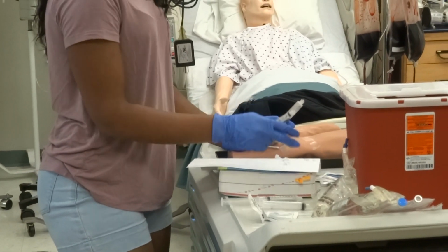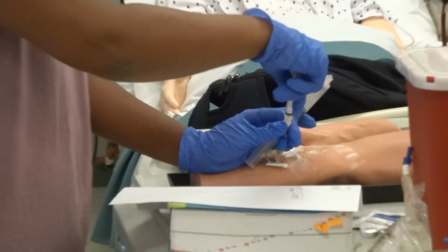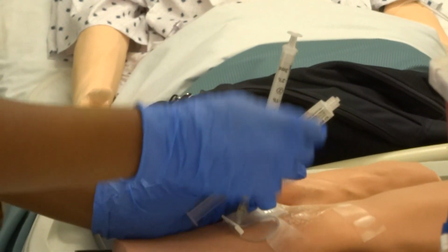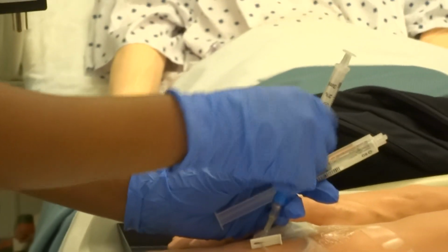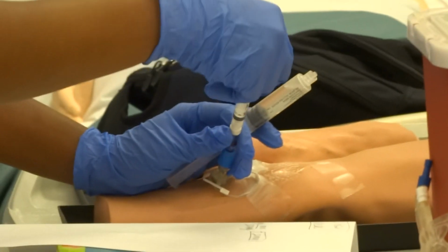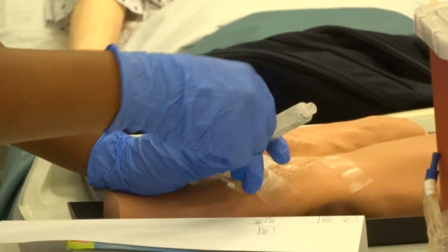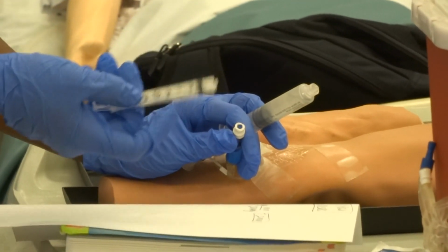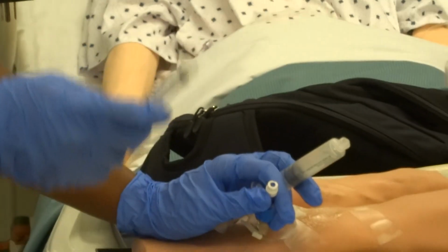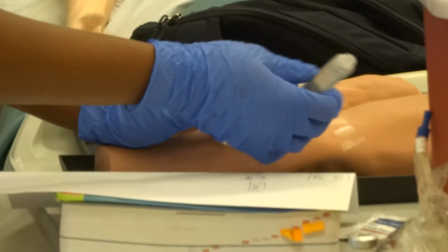Attach your syringe. You'd attach your syringe first, and then you go ahead and release this. Don't do it before. Just make sure it's locked. Attach this, make sure this is locked, unlock it, and then push the medication for however long. And then just show them that you're looking at your watch and that you're being safe and making sure you're pushing it at the prescribed rate according to the drug guide.